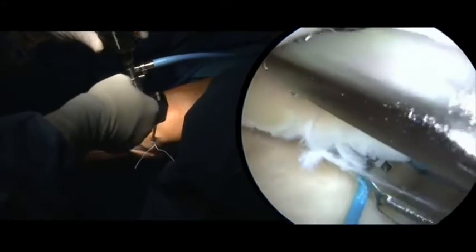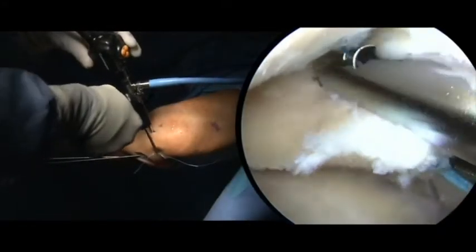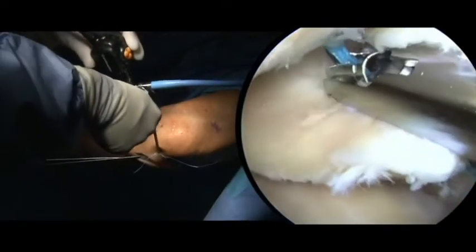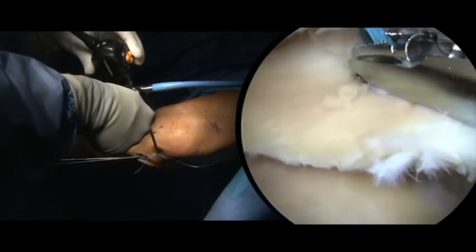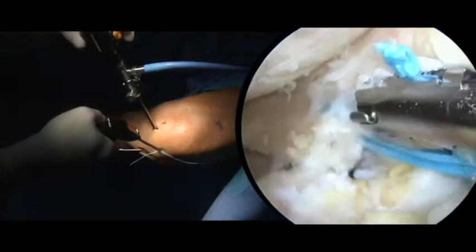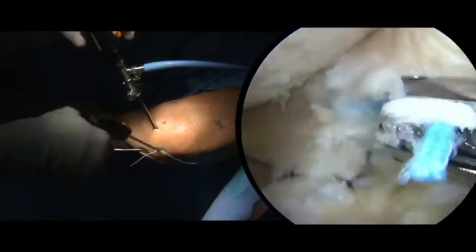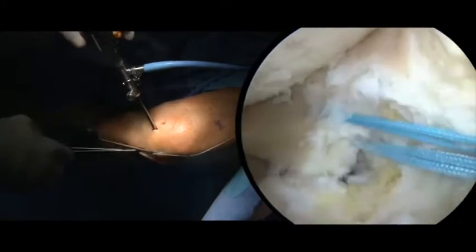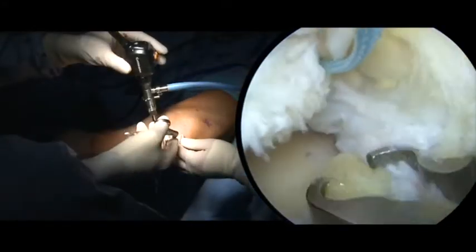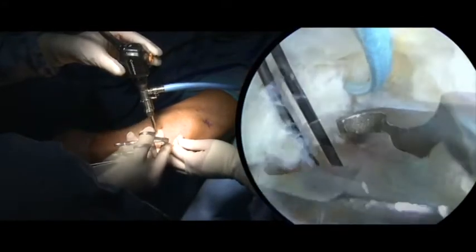A number 2 ultra braid suture is first passed through the posterior corner of each meniscal flap using a non-cutting needle. Typically, suture passage is performed through one anteromedial portal with a first-pass self-capture suture passer device.